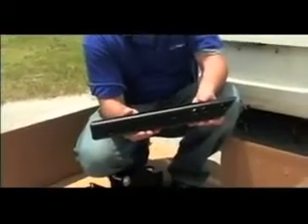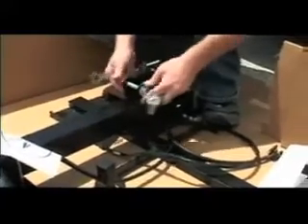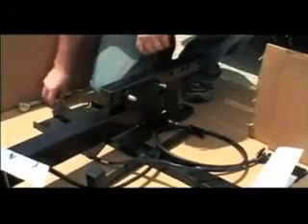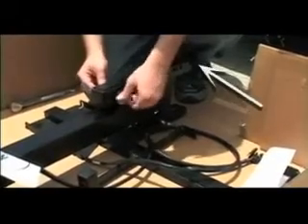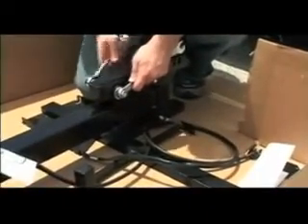Locate the hitch post from inside the box. Remove the mounting bolt on the lift and place the hitch post. Slide the bolt back in place and tighten. Attach the hitch post to the lift with the beveled area pointing down, away from the lift. Do not over tighten the bolt. This is a pivot point.